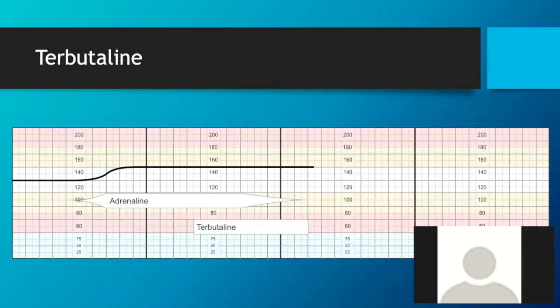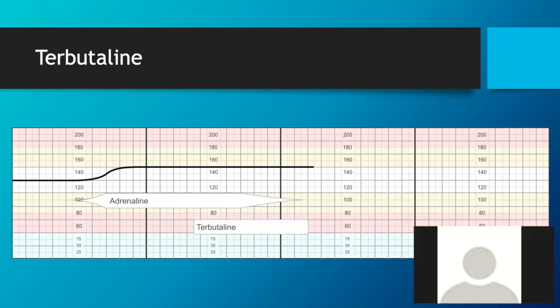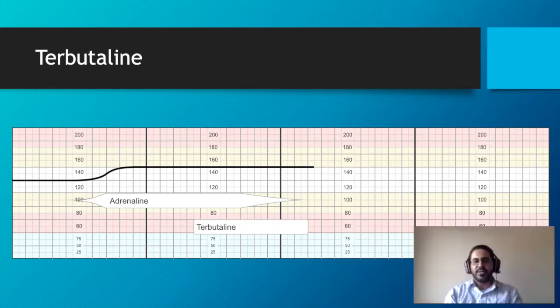Say that again. If the adrenaline is going down, would they maybe have some more accelerations? So the baby might start accelerating even before that, and stop decelerating. Not completely, unless you've completely taken all contractions away. It'll cycle again. So the first sign of improvement is that the contractions start spacing out. Yeah, that's your first sign of improvement.